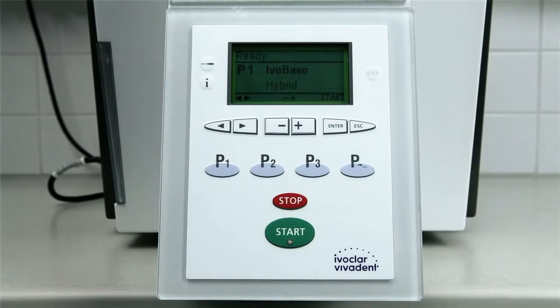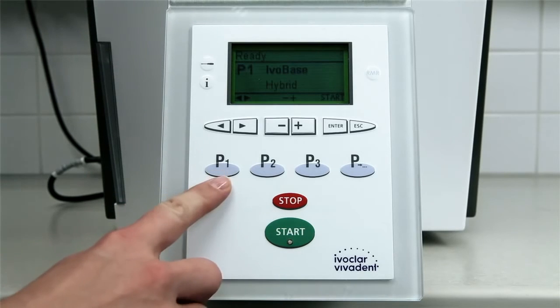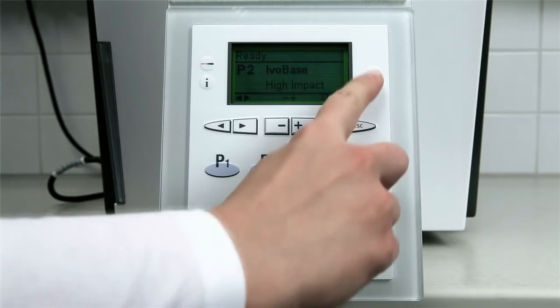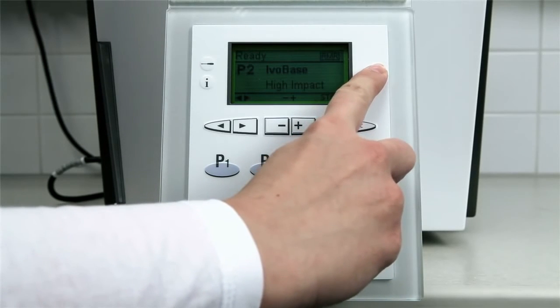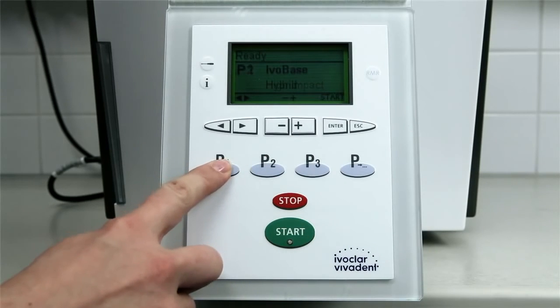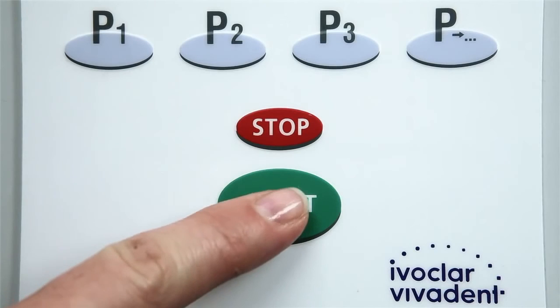For optimum results with IvoBase hybrid and IvoBase high impact, the IvoBase injector is equipped with polymerization programs especially designed for the respective materials. P1 for hybrid, P2 for high impact. To further reduce the residual monomer content, the optional RMR key can be activated. Select the corresponding program. Start the program.